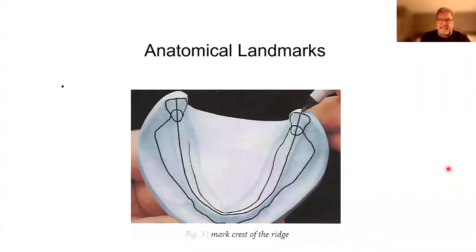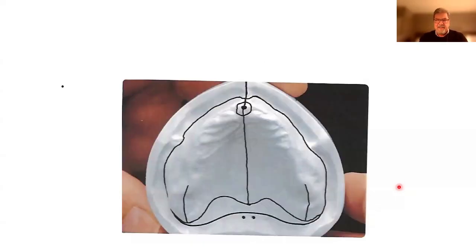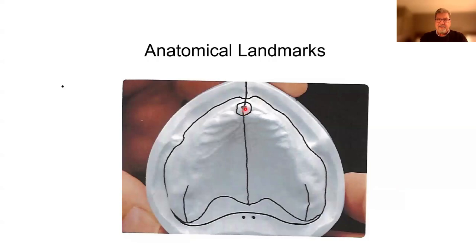And you look at the anatomical landmarks I mentioned earlier: two-thirds of the retromolar pad is where the final molar, the second molar, is going to be. And we want to keep those teeth, the posterior teeth, right on the crest of the ridge when we set up denture teeth, because anything off of the ridge is going to cause an unstable denture. And then anatomical landmarks, the papilla, are probably going to come out about 6 to 8 millimeters from here. There's sometimes 8 to 10 millimeters. And you want to make sure the hamular notch, you follow the ridge factor here and set these correctly.